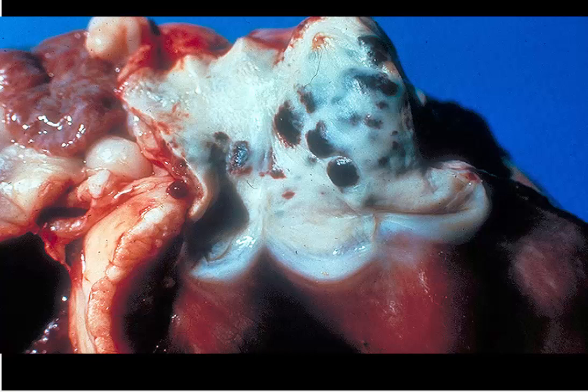Okay, time's up. This is a classic picture. Now it's in all the textbooks. And what we're looking at is the heart, and the opened pulmonary artery. At the base of the pulmonary artery, we have these multifocal hemorrhages. This is a classic lesion of bluetongue, which is caused by an ovine orbivirus. A very similar virus also causes epizootic hemorrhagic disease in deer, which looks almost identical. Okay, so we're looking at bluetongue.